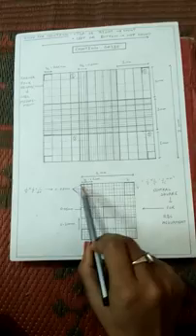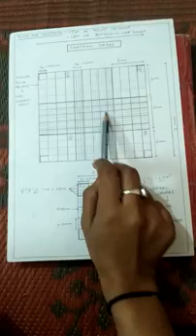And one important thing about this is that all the four corner squares, here you can see these dark lines, this whole small square, this one, this one, and in the last this small square, these five squares in the middle central square are used to measure the RBCs of blood. So these five sites, four at the corners and one in the middle, are used to count the number of RBCs in human blood.